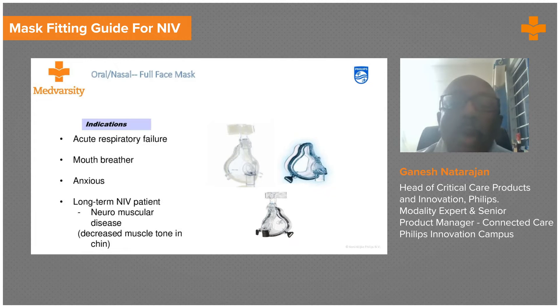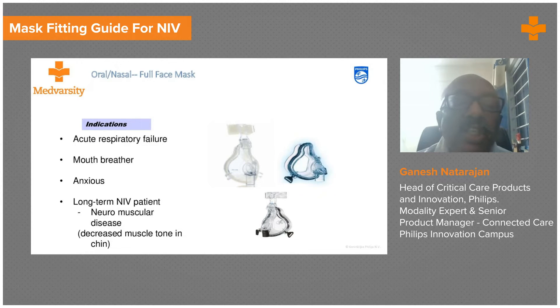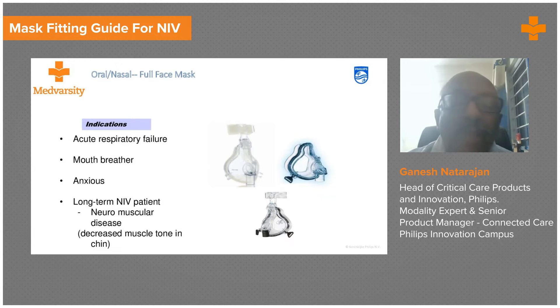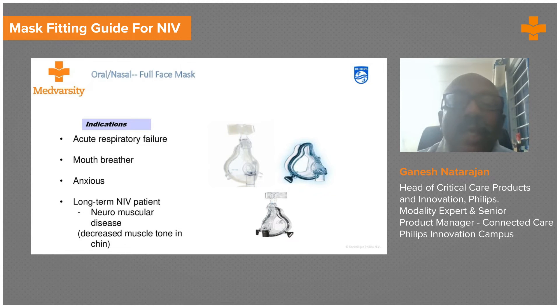The indications for an oral nasal mask include acute respiratory failure, partial mouth breathing, patient anxiety, and NM patients on longer-term ventilation. Oral nasal masks come in versions with a head support and as a standard oral nasal mask.